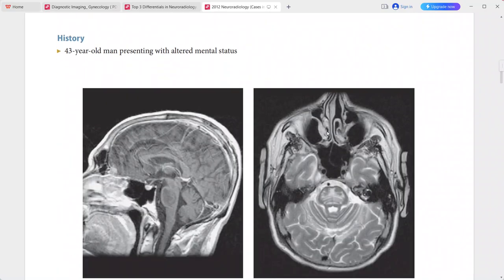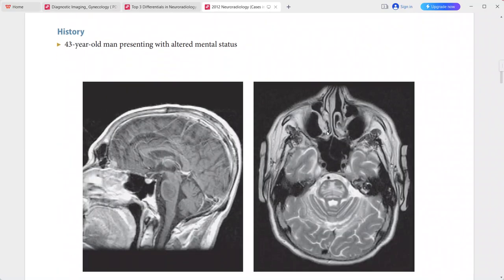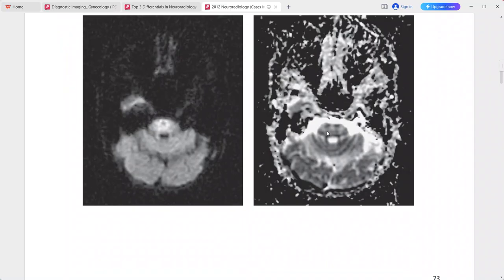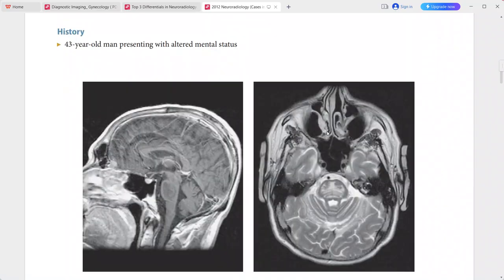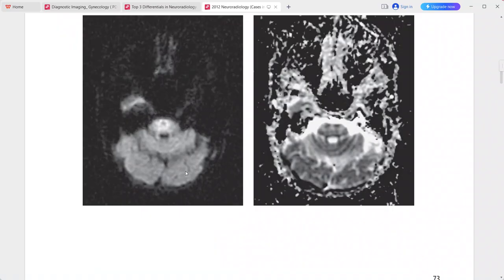Next: a 43-year-old man presenting with altered mental status. There is signal abnormality within the central pons, hyperintense on T2-weighted images, sparing the periphery and the corticospinal tracts. On post-contrast sequence there is no abnormal enhancement.